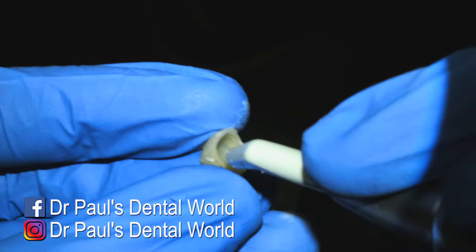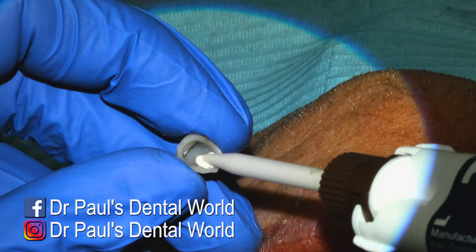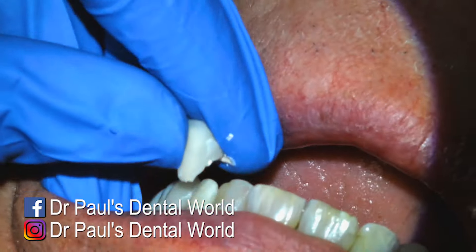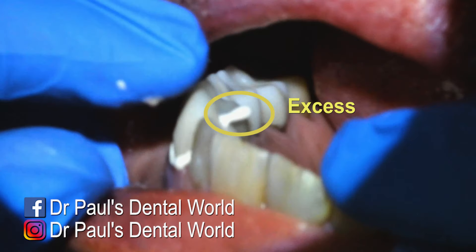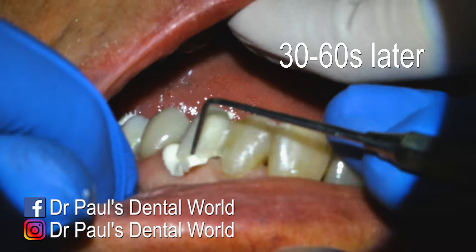And then I'm just clearing out the excess material here with the triplex. And then I'll dry the tooth before we actually come to cement it into place. And then I'm loading in my temporary cement and positioning it over the top of the tooth. In this case, I'm just pushing down on the actual cusp tip. And you can see there where the excess has come out on the palatal, and we've got a lot of excess around the margin. So I'm really happy with the fit of this.